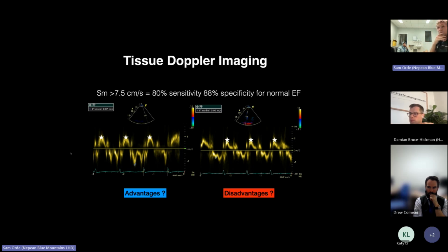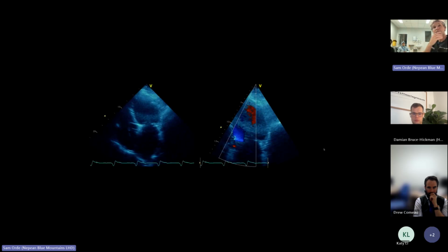What about disadvantages? I think the disadvantages will be possibly all the criteria about how to optimize it. So how it needs to be on plane, the right position. Perfect. And then the last thing is to talk about translational error. So anytime you're measuring a pulse wave thing, the heart's going to swing around in some way. So we call that translational error. So we're not absolutely certain we're actually measuring the annulus movement because it kind of comes in and out. Very nice.